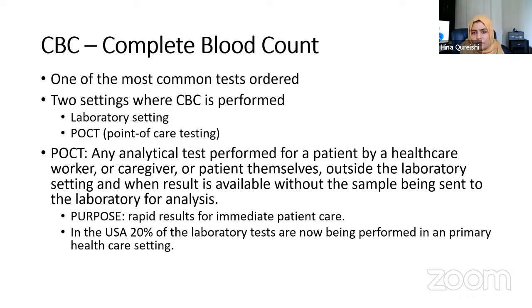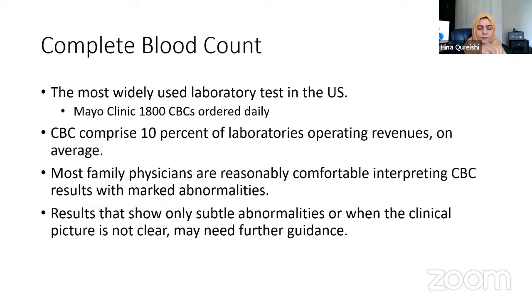CBC is one of the point of care tests that is done in a lot of the clinic settings. In the USA, about 20% of laboratory tests are now being performed in a primary care healthcare setting. So CBC is not only utilized by hematologists and hematopathologists, but it's actually a test that is interpreted by a lot of our primary care colleagues as well.